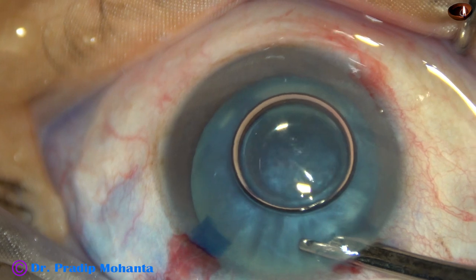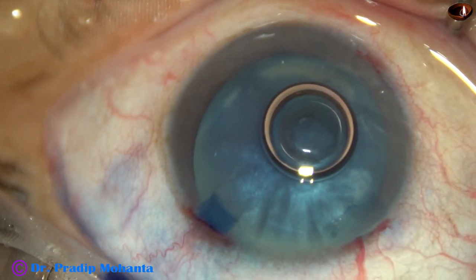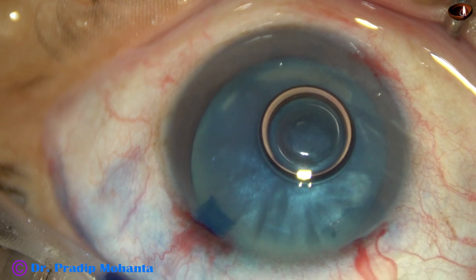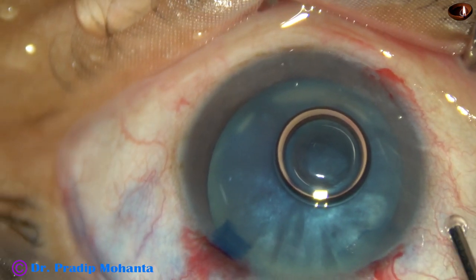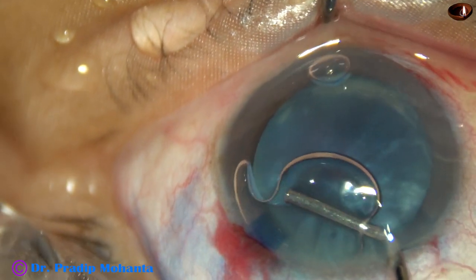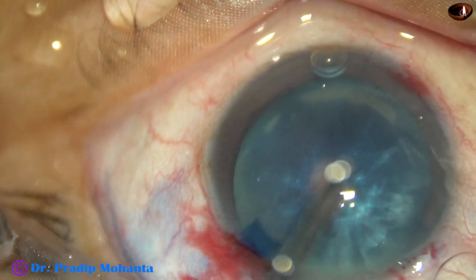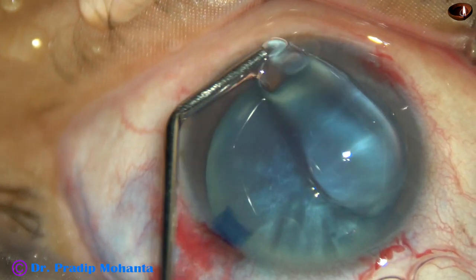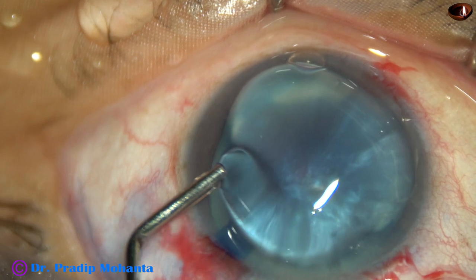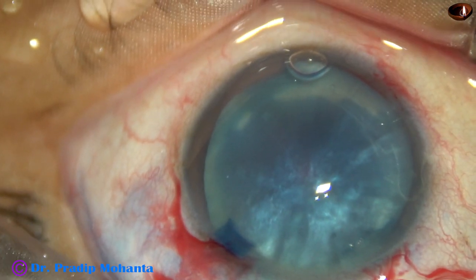Then 2% hydroxypropylmethylcellulose is used as OVD. HPMC is injected into the anterior chamber and the air bubble is replaced by the HPMC. HPMC is also applied over the cornea to improve visibility.